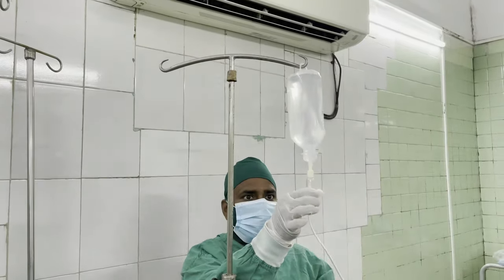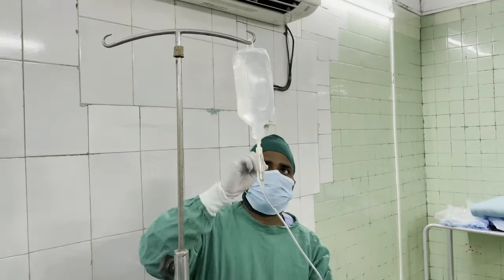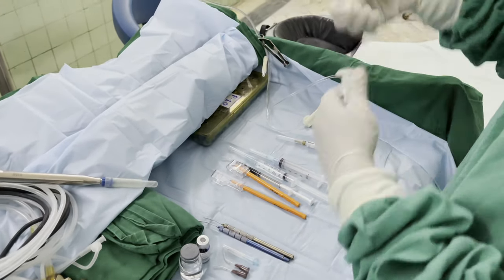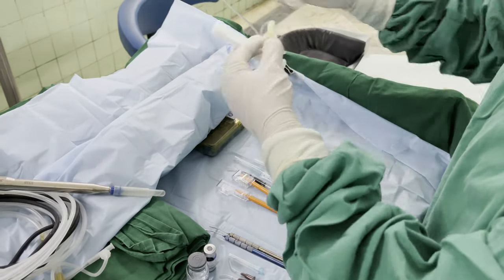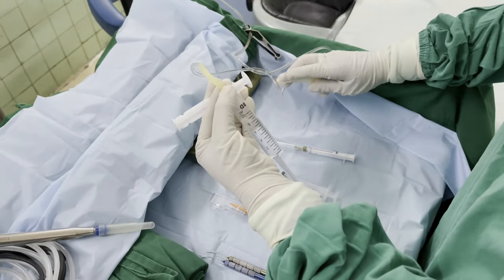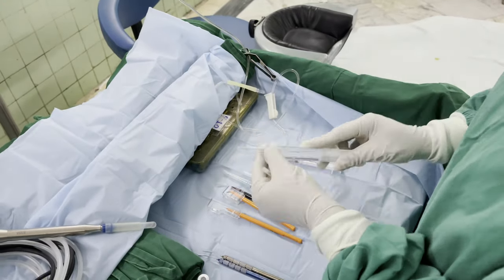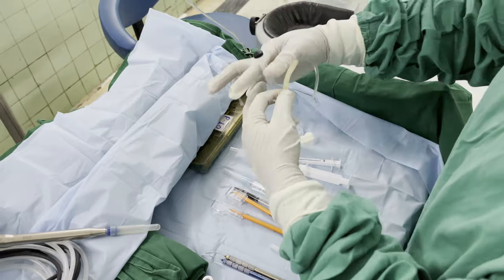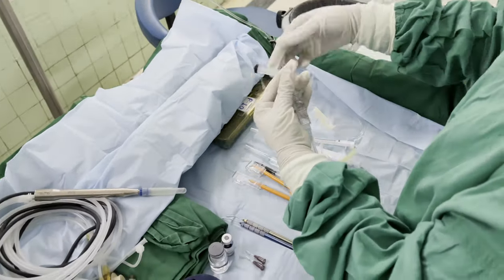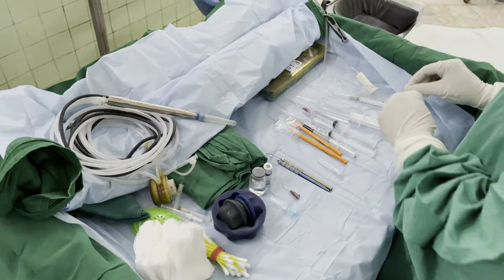This is now hung up on an IV stand, and it's now largely ready for use. Sister now will fill up the fluid in the different syringes directly from the IV set. At the outset, she fills up the 10 ml syringe, which is used to hydrate the cornea intraoperatively. And then fills up a 5 ml syringe, which is used for the hydro procedures and for stromal hydration itself. The trolley is now ready for the phaco emulsification procedure.